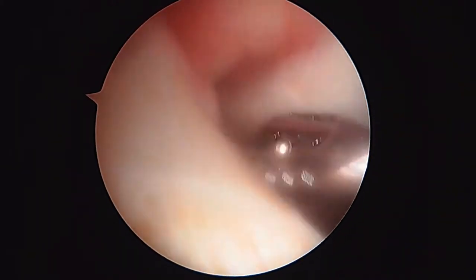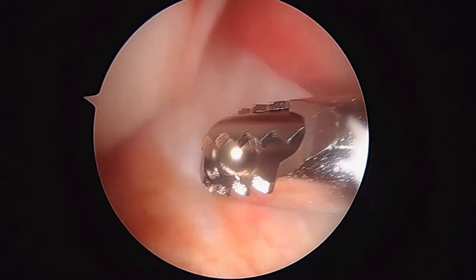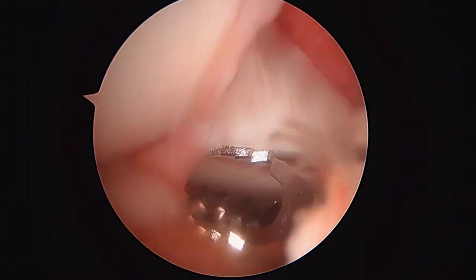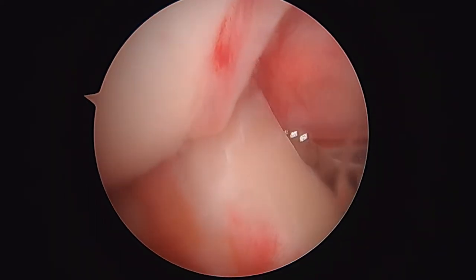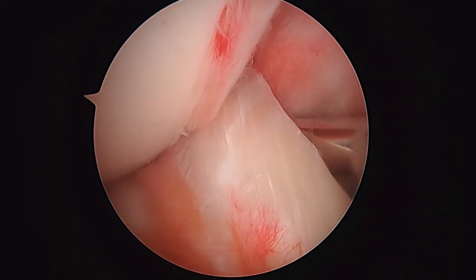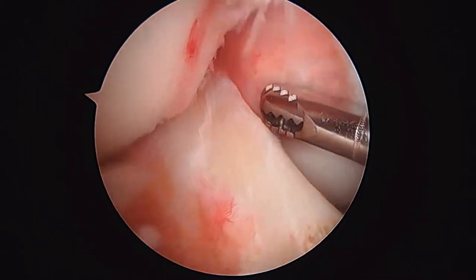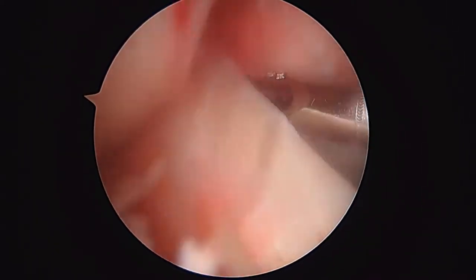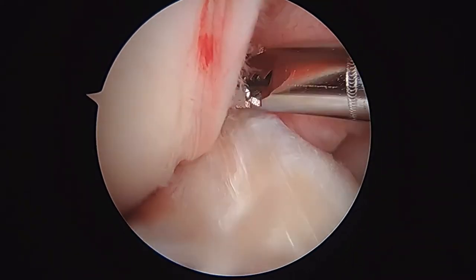We're going to look in the central part of the knee. This is the notch where the anterior cruciate ligament is — so here's the ACL right here. That looks great. The posterior cruciate ligament is going to be behind here.